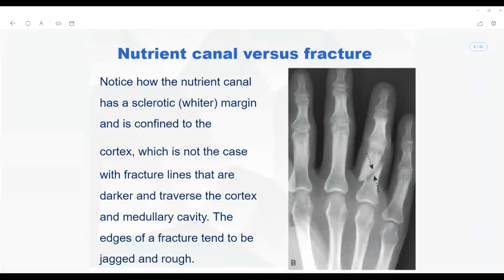Okay, at least some hand. Which hand? So it is the ring finger, okay? Is the ring finger the third or the fourth? Fourth. So why does everybody keep saying it as the third? Of course, you have to include the thumb. Why are you excluding the thumb in this scenario?